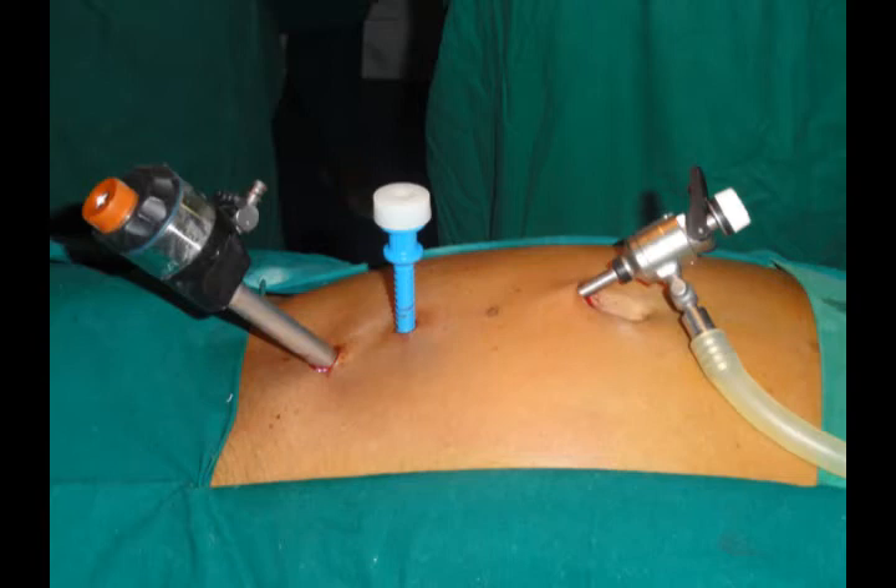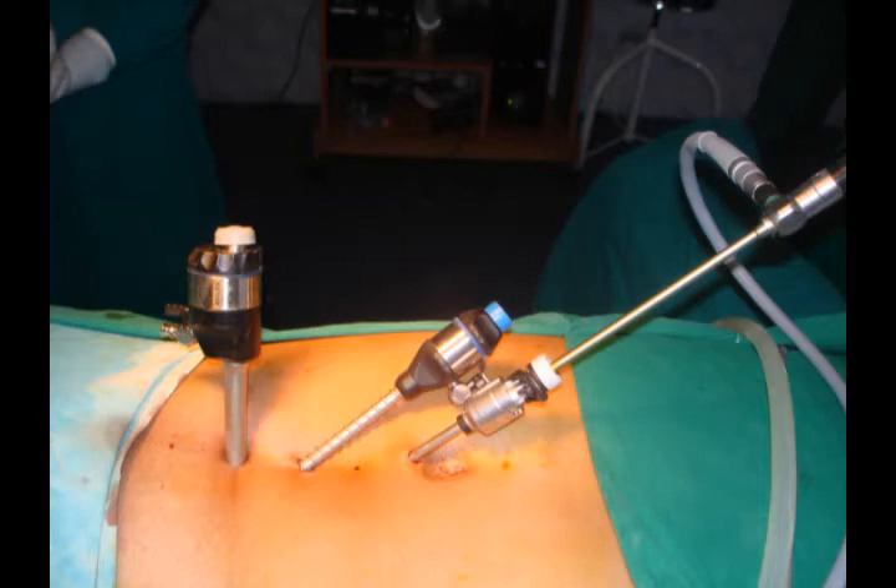This scar will not be seen because it's just suprapubic. The upper two ports are the camera port and the middle 5 mm port, and the lower-most is the 10 mm port for insertion of the prolene mesh.